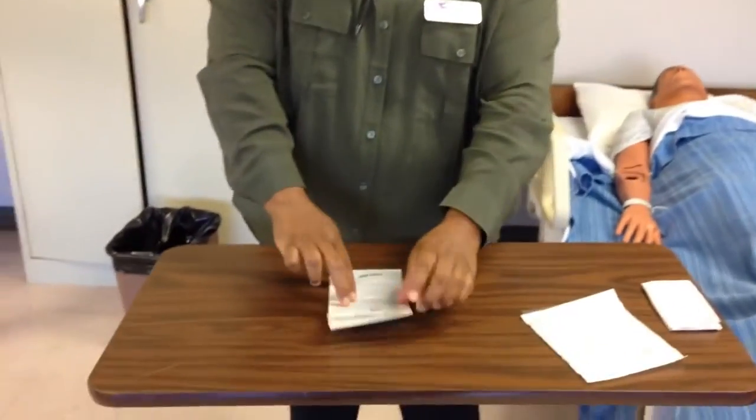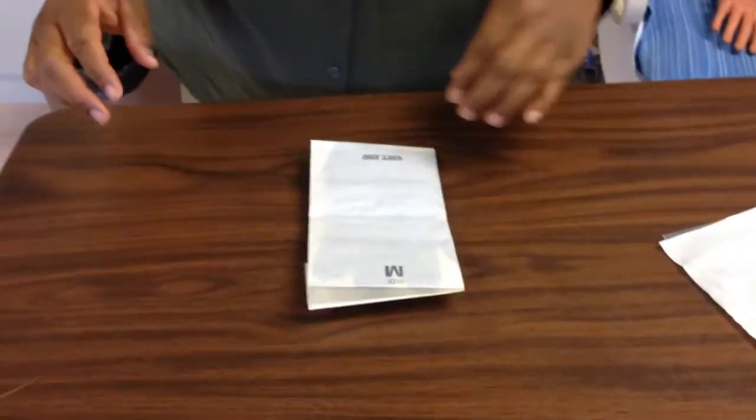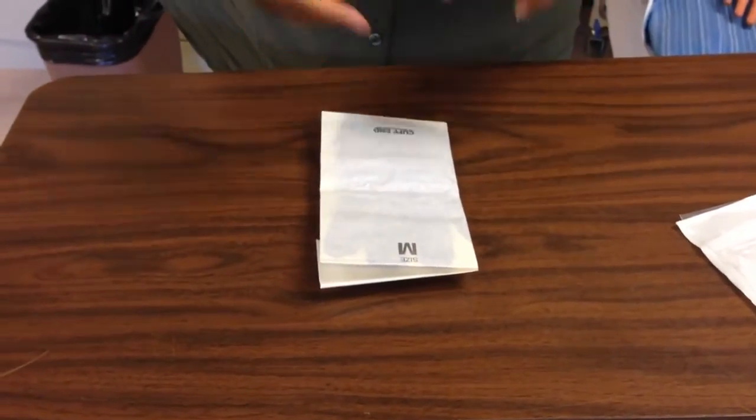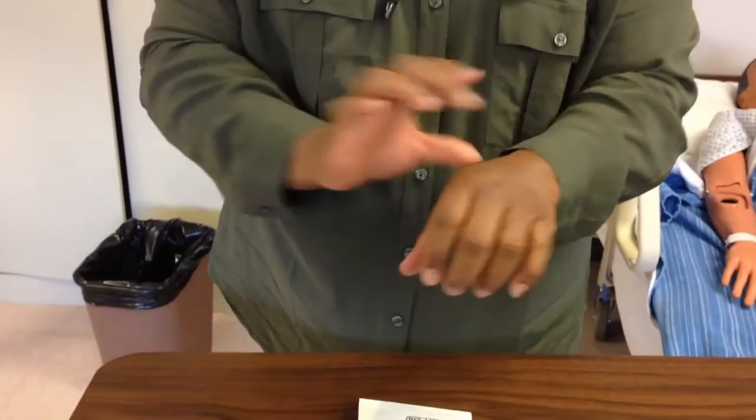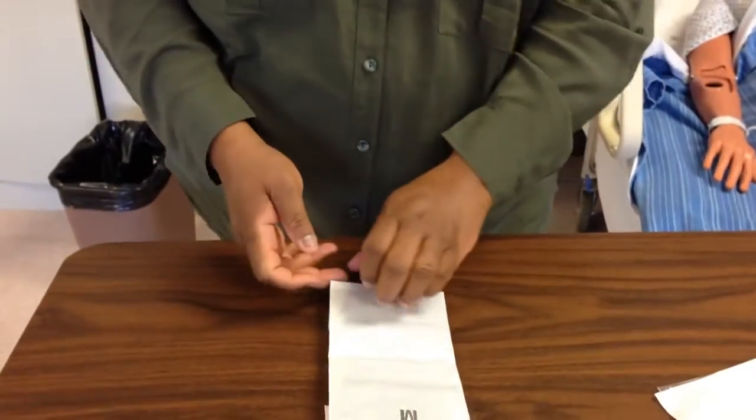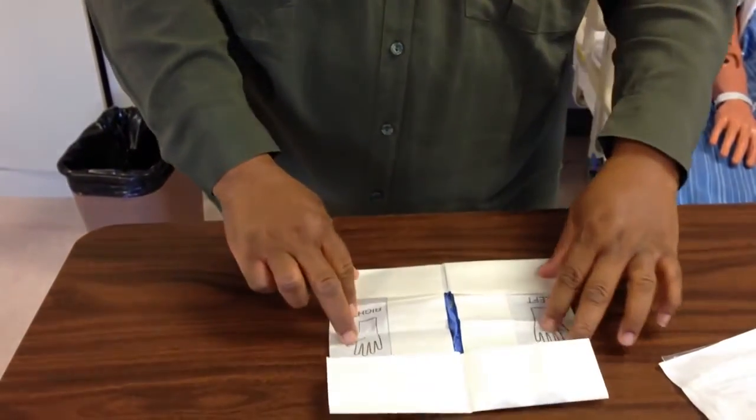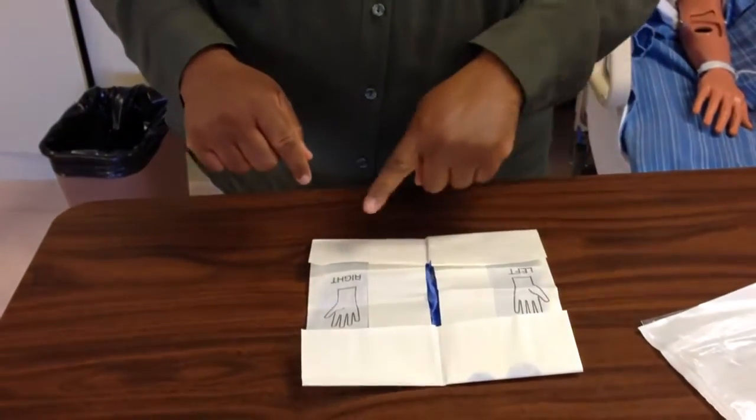I'm going to carefully open my sterile gloves and it says cuff in. That's the portion that will be around my wrist, the cuff. It says right and left.